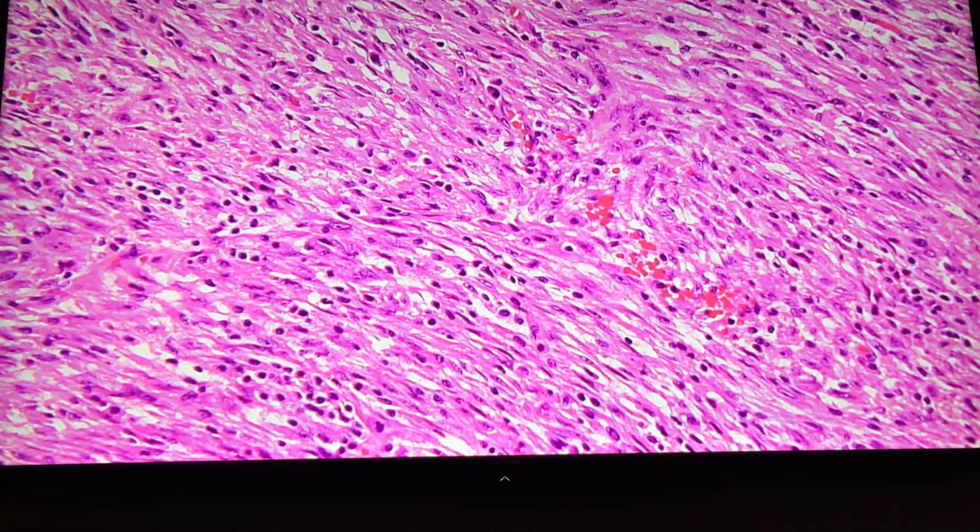Now this could be other things, of course. It could be a desmoplastic melanoma or some other kind of benign spindle cell tumor. So you want a stain that works or some kind of confirmation, right? ALK, but it's only positive in about 40% of the cases. So ALK can be relatively insensitive. One thing you can do is use an ultra-sensitive ALK, which we use for lung cancer, the D5F3, and that picks up a much higher percentage than standard ALK.